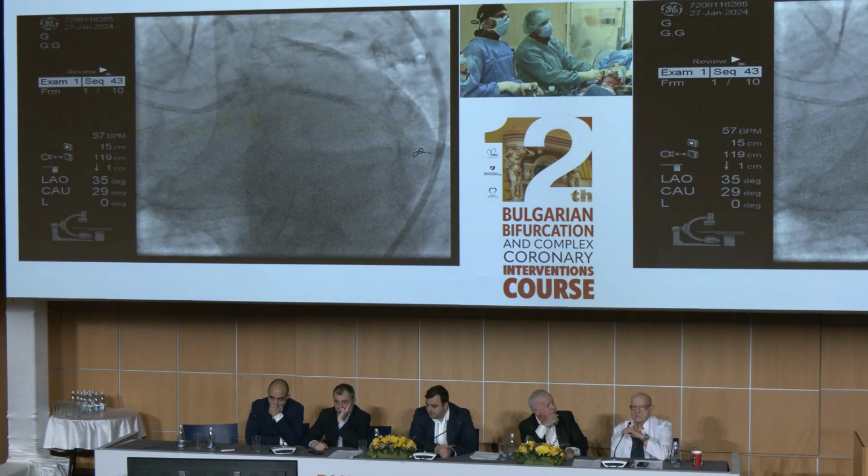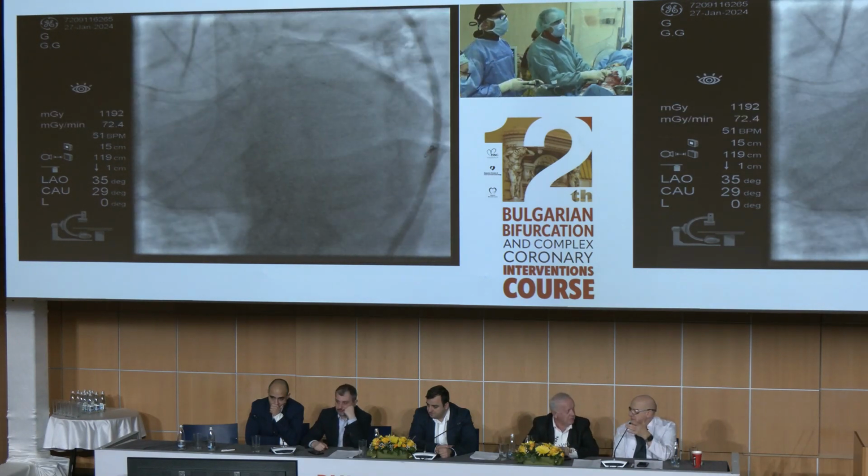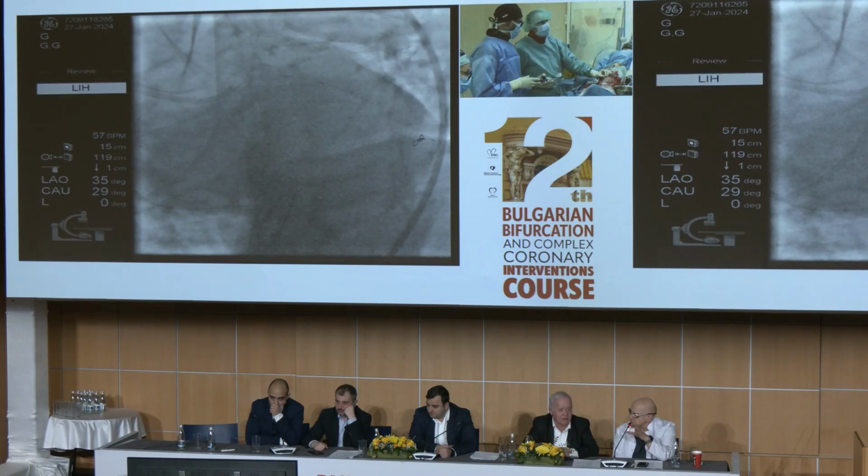No, you are absolutely right, because these nominal rates of the balloons are ex vivo, and they are not even in such tissue as calcium, even in a normal vessel.